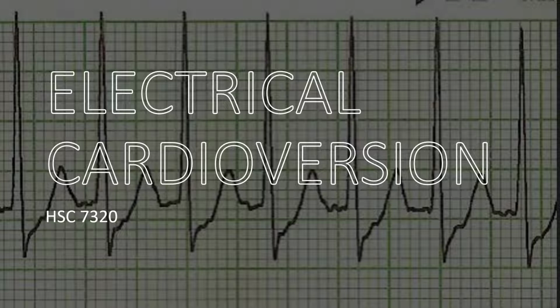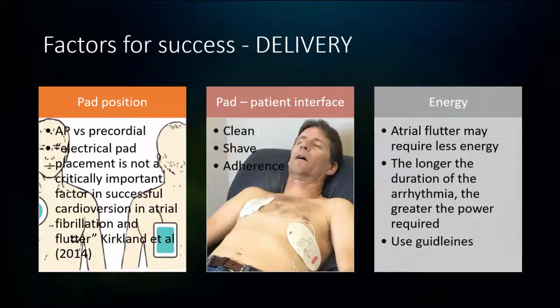In terms of getting this to be successful, clinicians can look at two sets of modifiable factors that will contribute to the success of the cardioversion. So let's go on and look at these. The first of these factors are related to the delivery of the shock itself. And the critical element that we need to ensure is that the bulk of the defibrillator's energy is delivered to the myocardium.